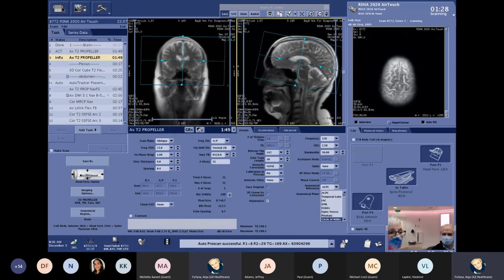That again helps a great deal in being consistent. So when your patient is coming for a follow-up because he's a tumor patient or an MS patient, there's no need to get all images on the scanner. You don't have to look at how you prescribed the last time. Every time you use RX, the system will do the same job, and that really helps a lot.